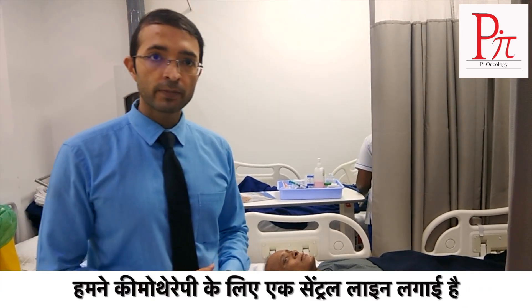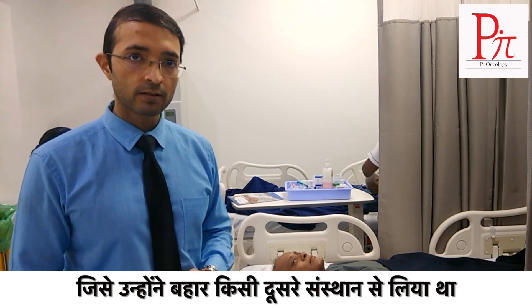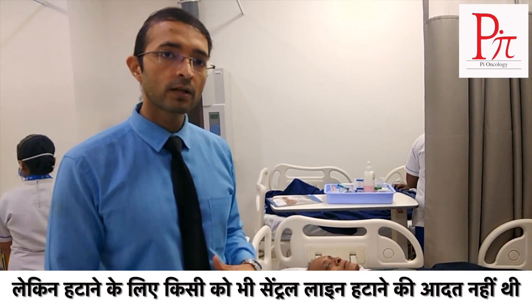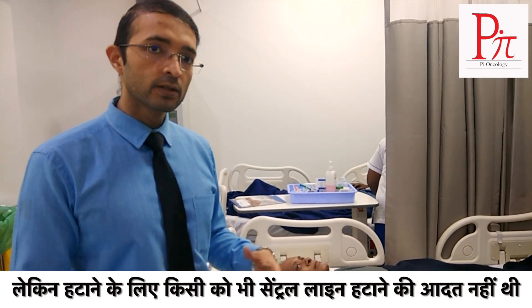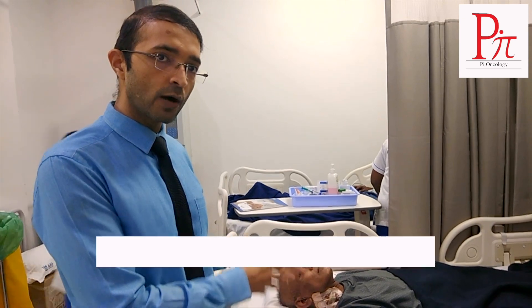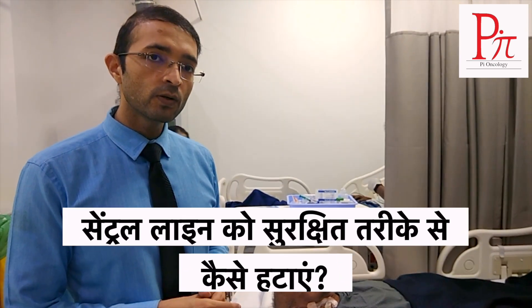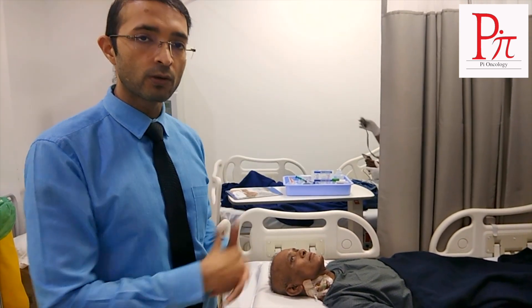The purpose of the video is, we have put a centerline for chemotherapy which he took outside at different institutes, different hospitals. But for the removal, nobody was habitual of removing this centerline. So here we are showing you how to remove this centerline safely. After seeing this video, the patient or any medical staff can remove the centerline at local hospitals.